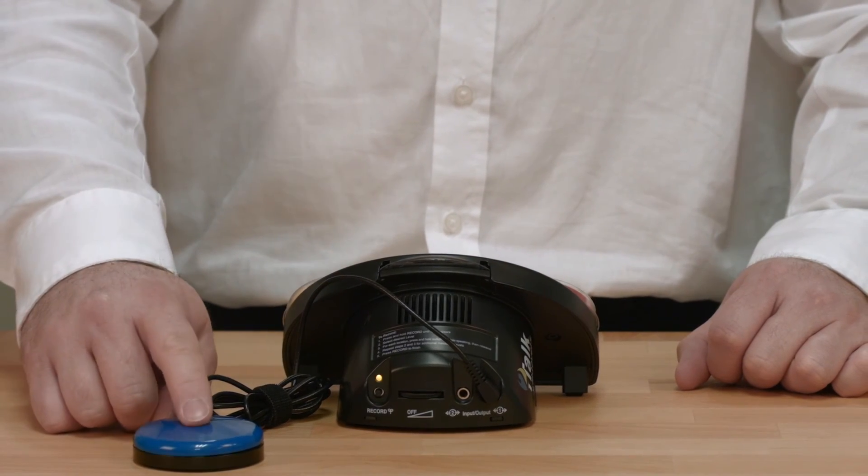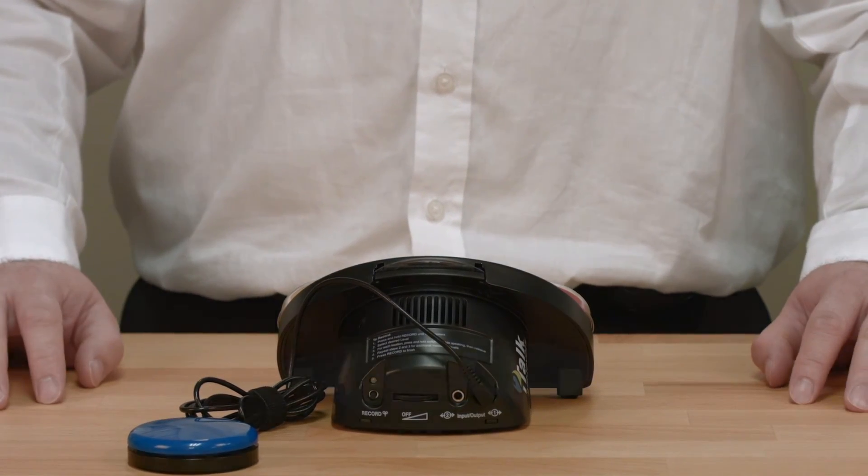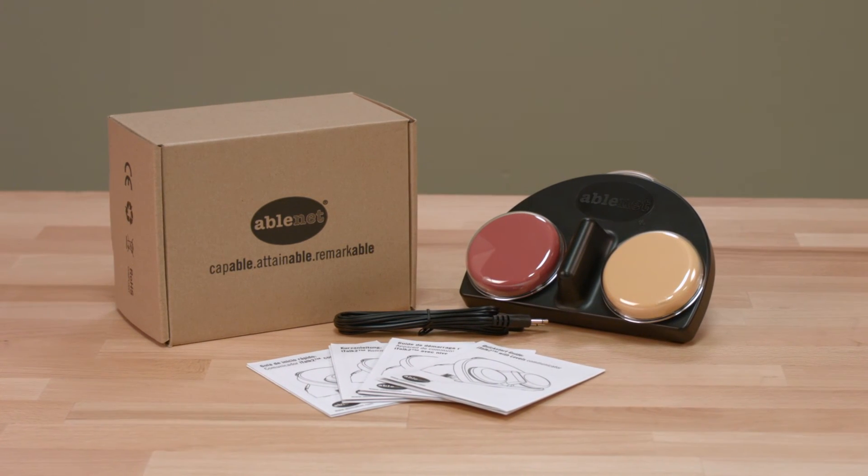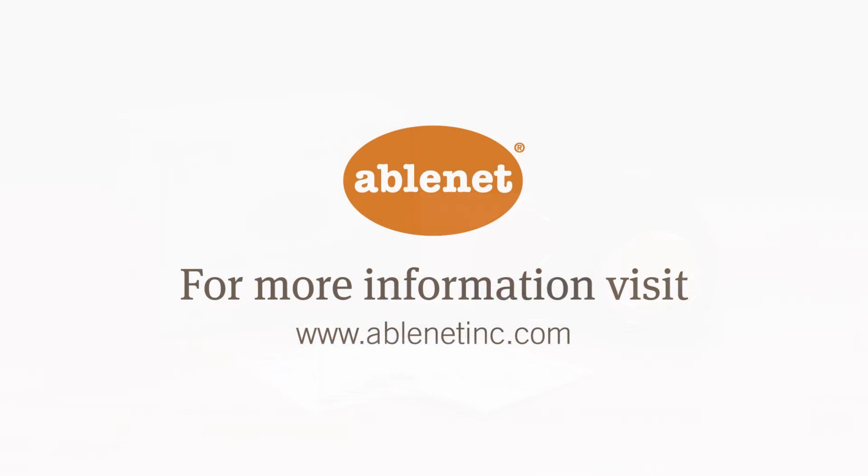Once you are familiar with the message recording process, you will be able to easily change out messages on the fly to meet the needs of almost any communication scenario throughout the day. To learn more about the iTalk 2 with Levels from Ablenet or our entire line of products, visit us at www.ablenetinc.com.